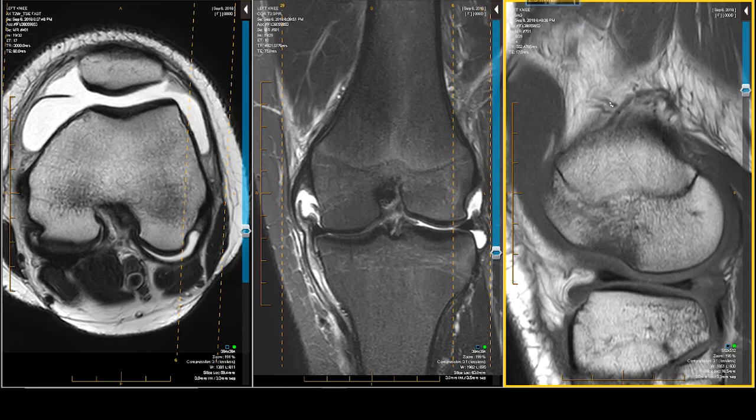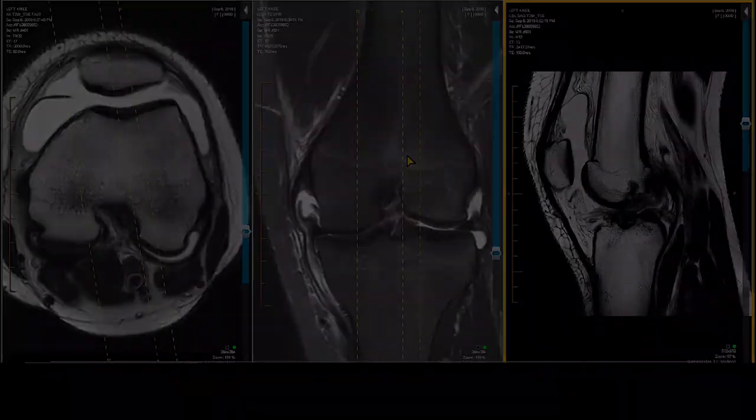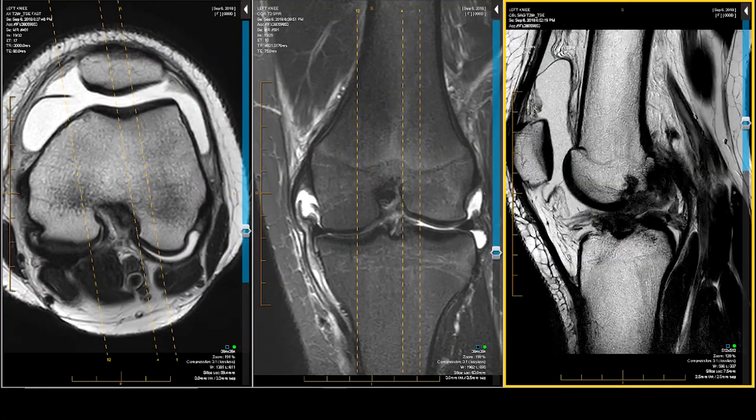I'll also have some specialized views. For instance, I'll have a view right along the line of the anterior cruciate ligament. If the cruciate ligament runs like this, my sagittal will go right down the barrel of that — a sagittal oblique. This one happens to be very up and down, so it's almost a straight sagittal, but it shows the status of the anterior cruciate ligament.